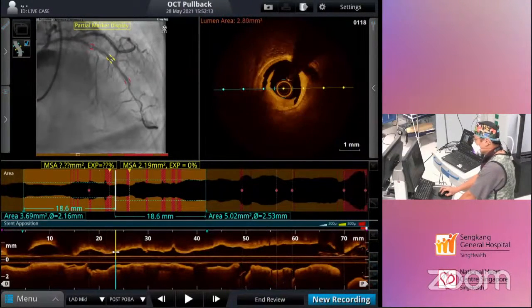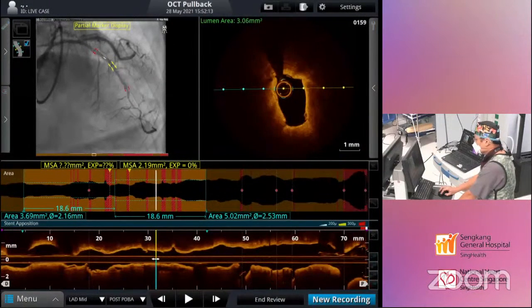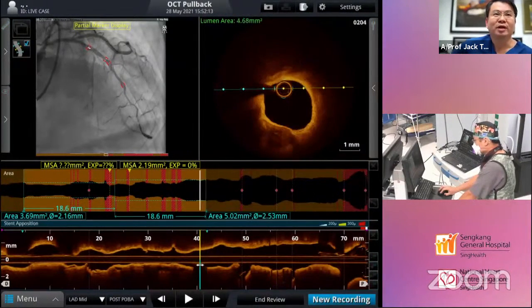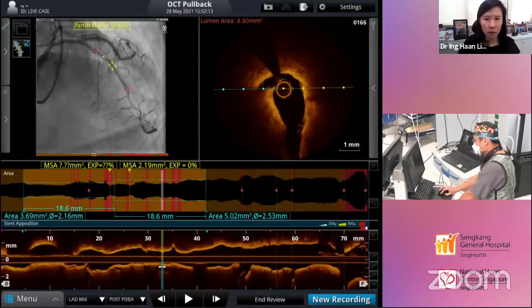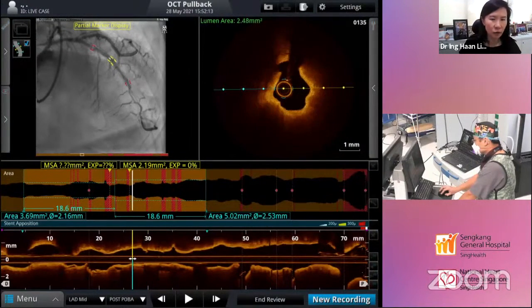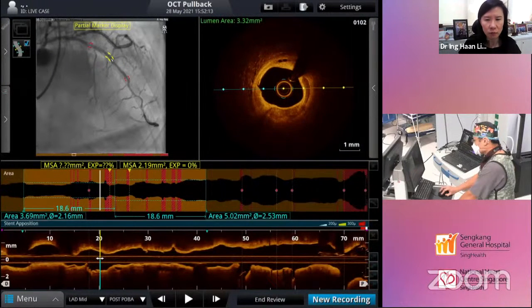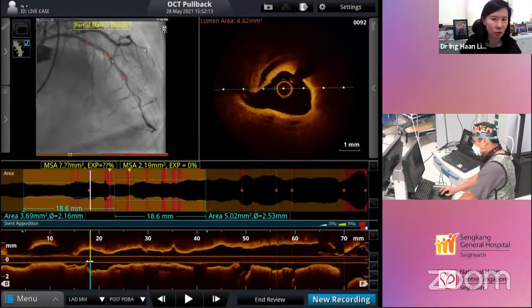And I think on the angio, the balloon does inflate quite well, quite fully. So maybe I'd like to ask Inhan, who advocated atherectomy, is this okay, you think, based on fluoro and OCT post? Yes, based on the fluoro, it looks really good. At this point, I'm quite confident that we should be able to put in stents. Based on the OCT, I'm looking at the dissections and trying to figure out whether the dissection actually went through the media, but these are deep, extensive dissections.